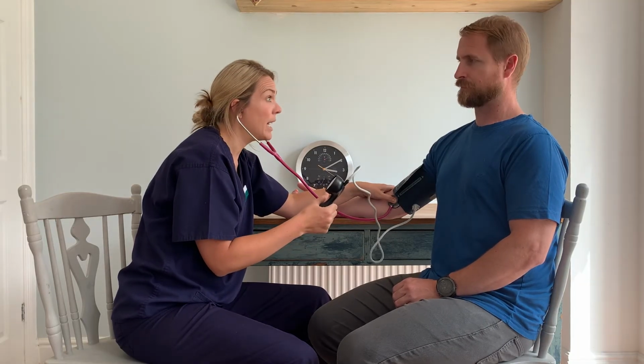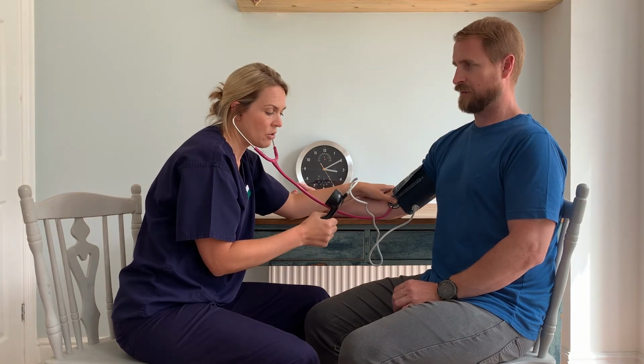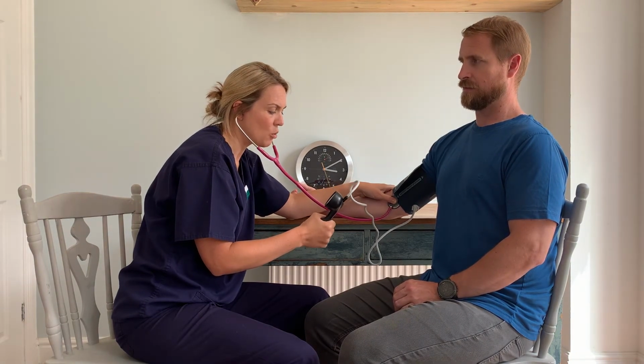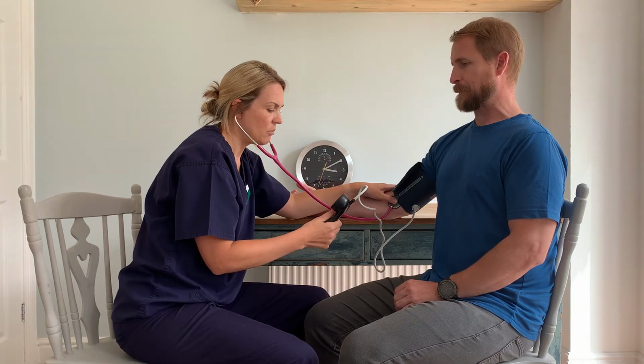And I'm going to pump up again, so it's just going to get tight around your arm again there, Dan, alright? So I'm going to pump up to 150 millimetres of mercury now, so it's 20 millimetres of mercury above this estimated systolic reading. Now I'm going to release the valve on the side of the gauge, really slowly. It's going to go down. Each of the little markers on here counts for 2, so I'm going to release it down slowly every couple of seconds, releasing a little bit of air out of that cuff.